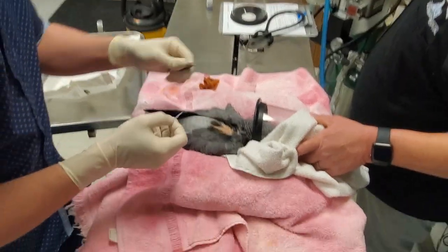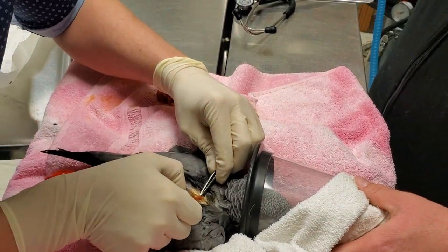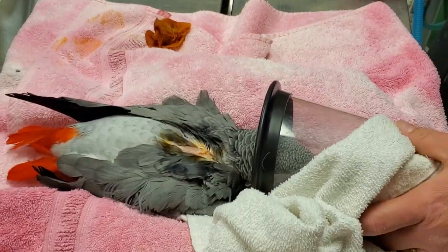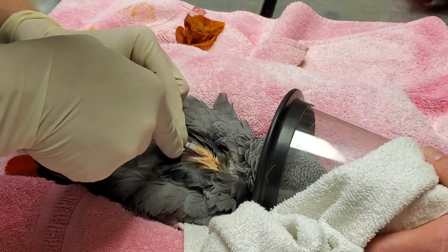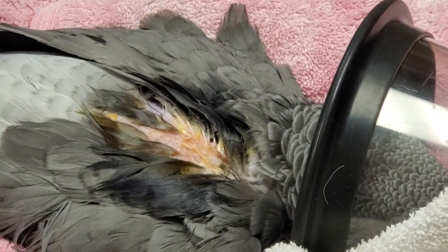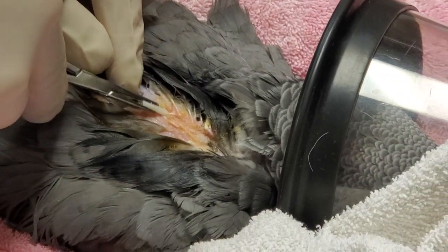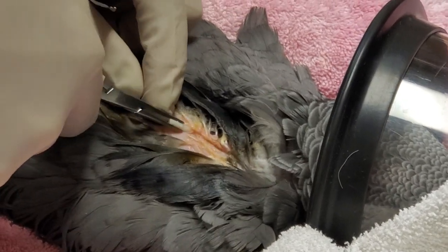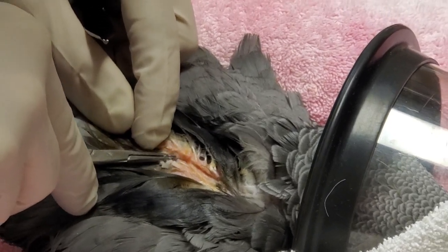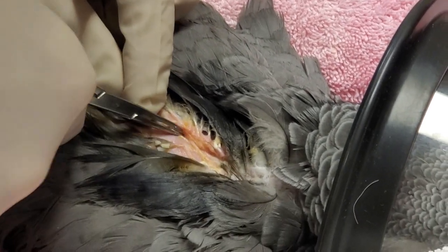We'll make a single incision by tenting the skin. Small punch — punch into the skin. Use the hemostats to make a small tunnel to make room for the implant. Cross the implant with the hemostats gently, so you don't want it to break. Insert the implant into the tunnel that was created. There you can see that I did have it fragment just a tiny bit — I'm going to try and put that fragment in.